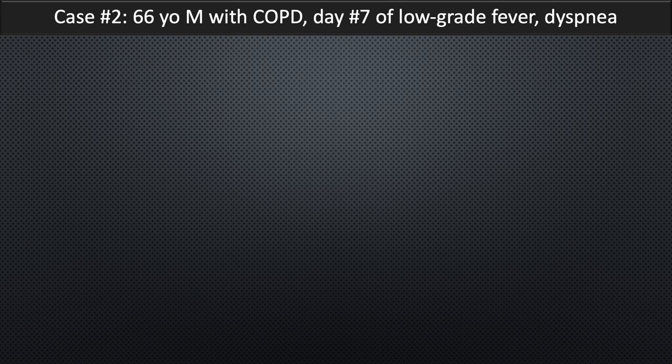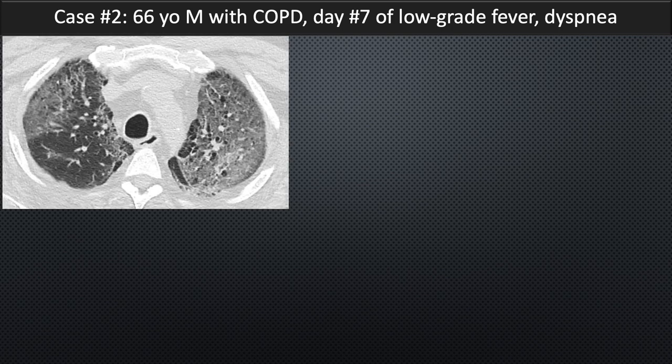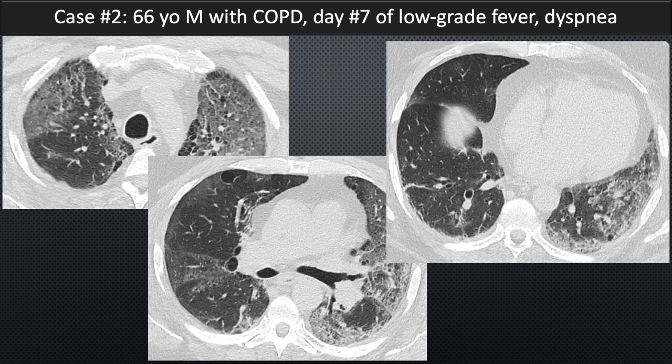Case 2: a 66-year-old male with COPD, day seven of low-grade fever and dyspnea. A CT of the chest shows not only underlying emphysema — paraseptal and centrilobular — but also extensive multifocal confluent ground glass opacities bilaterally. This is another pattern that can be seen with COVID-19 associated pneumonia. The patient was tested and the PCR came back positive for COVID-19, confirming the diagnosis.